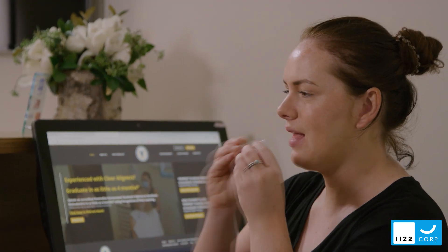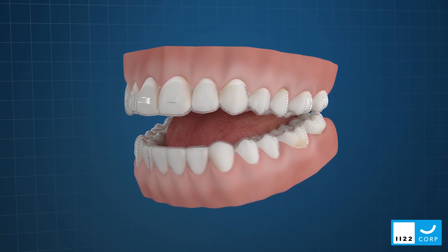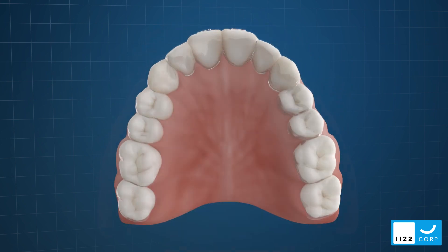Munchies devices are used to optimize the seating of orthodontic clear aligners and retainers. They ensure that orthodontic forces are delivered accurately and that tooth movements occur as predictably and comfortably as possible.